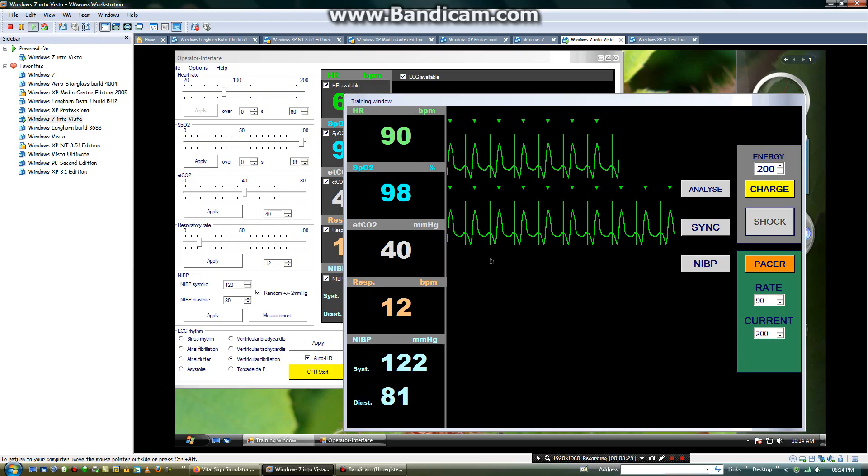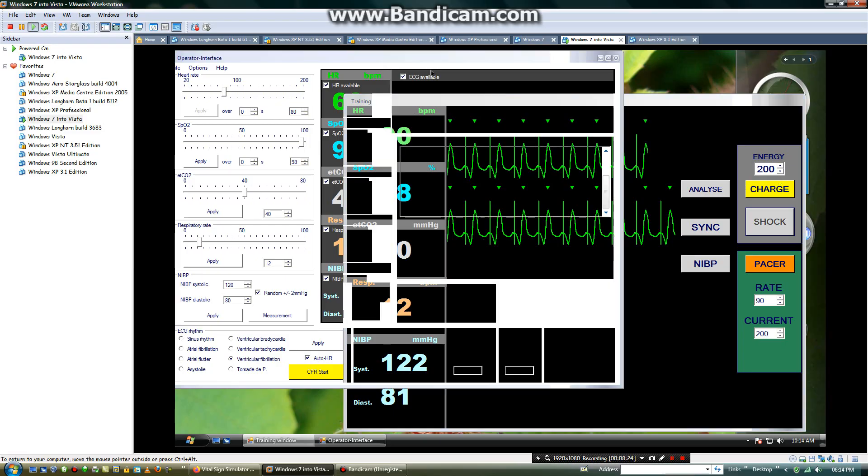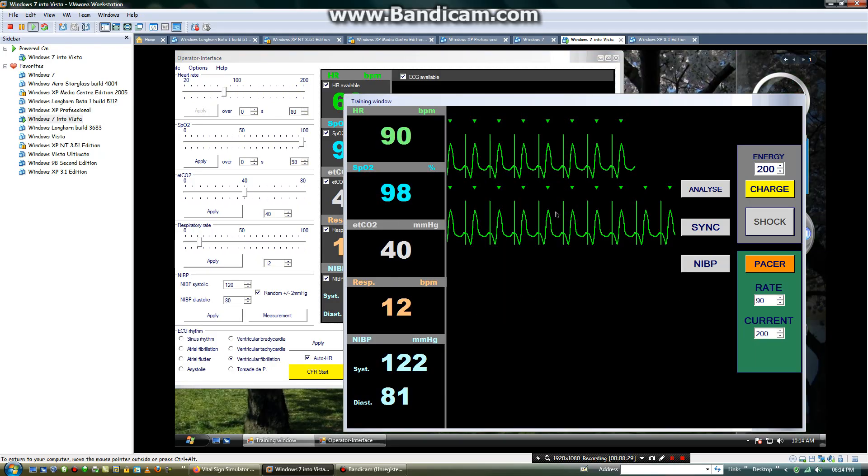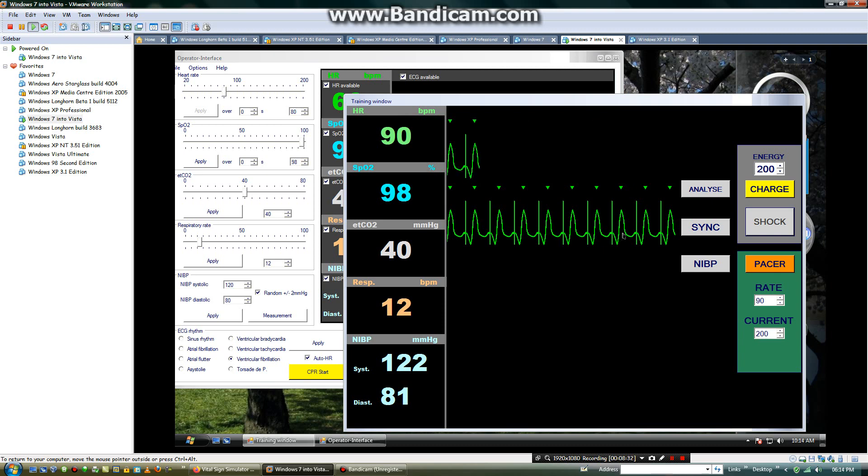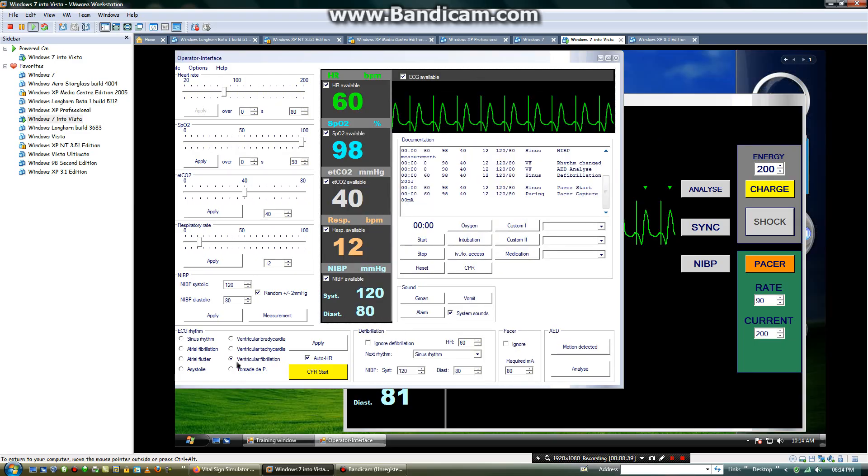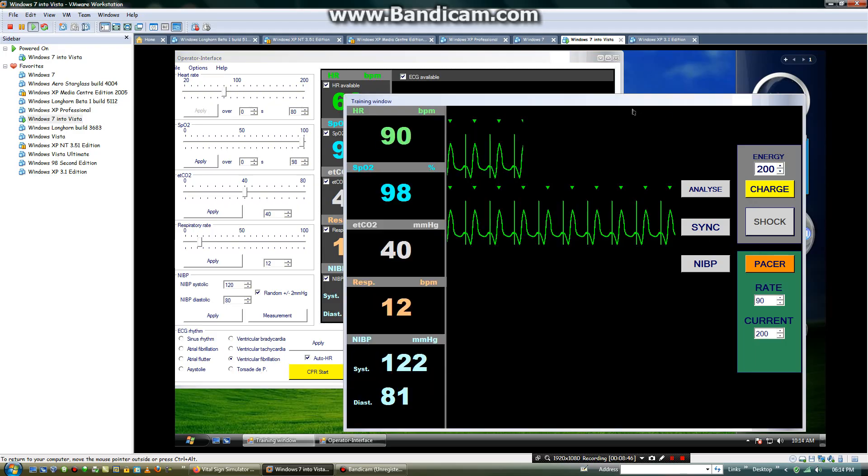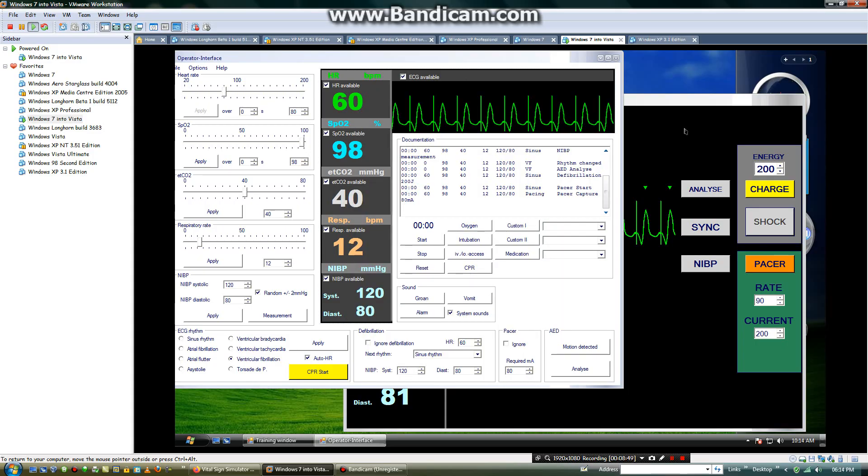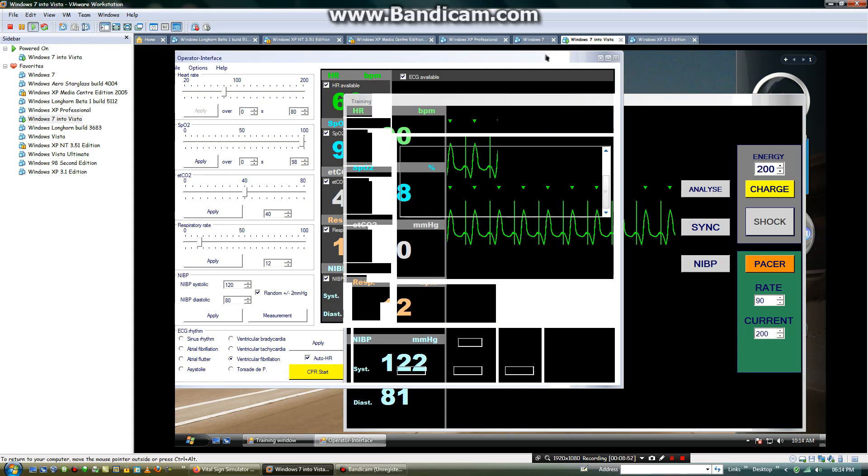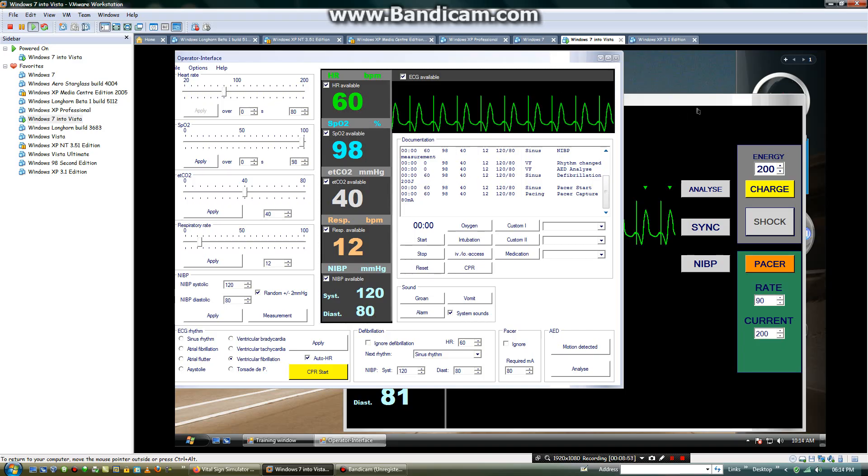And this is how a patient monitor works. You can also use the defibrillator each time when this prompts you to. Now, for this, again you need to change it to ventricular fibrillation and then you need to charge and shock the defibrillator again and again when you hear this prompt. Start the CPR and each time this prompt will appear and that's how you defibrillate.